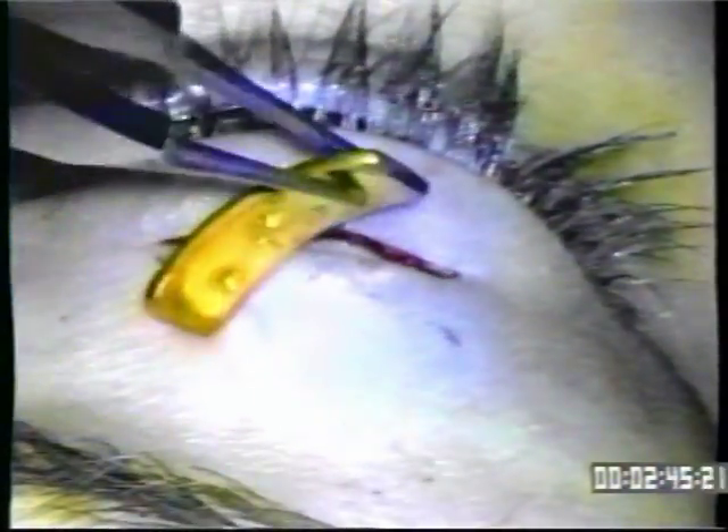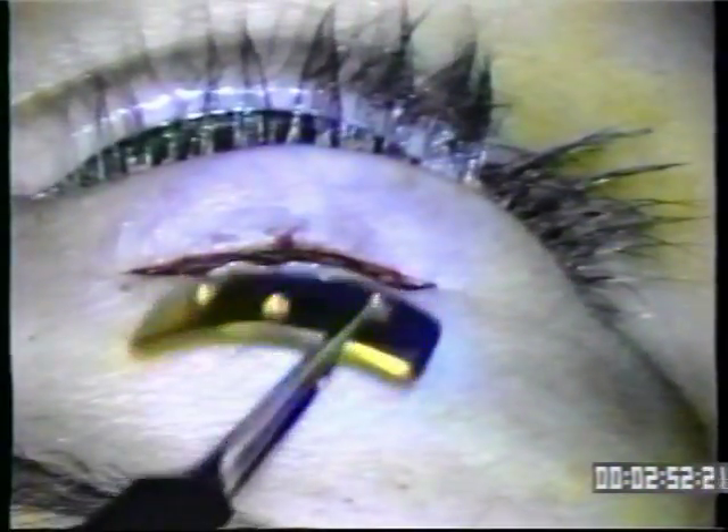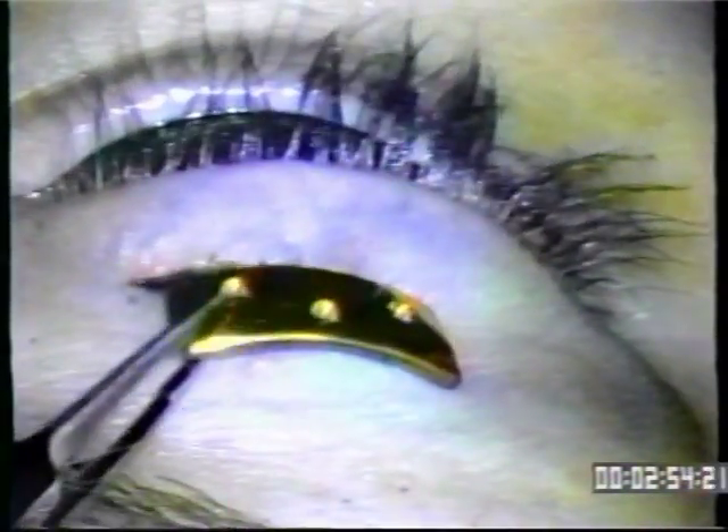This is a 1.2 gram gold weight. It has three holes in it. The lower hole will be toward the lash line and the other two holes will be toward the orbital septum. We turn it around so that the single hole on the bottom is down toward the lashes.